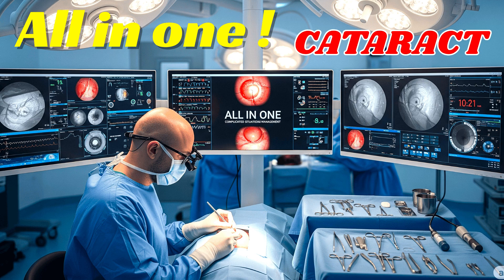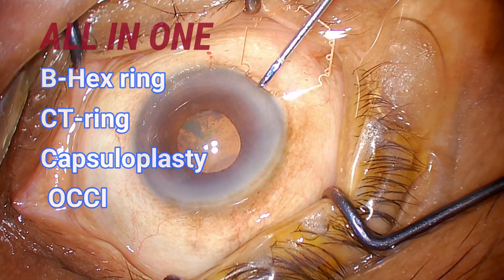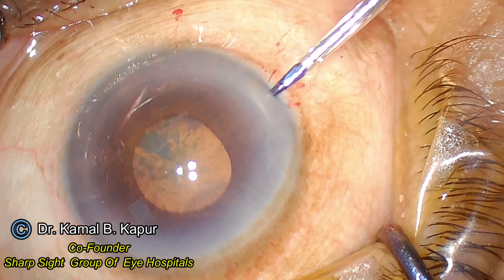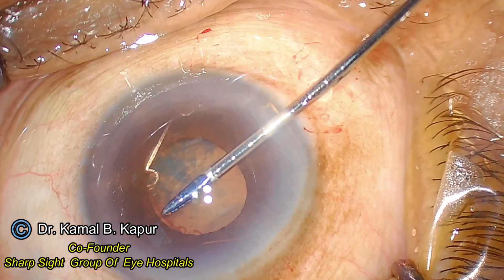This is an interesting case where the pupil is mid-dilated and non-dilating. There is a capsular zonular weakness which we will notice. The capsulorhexis was very small and vertically linearly oval, which required capsuloplasty, followed by a correction of 0.8 diopters of astigmatism because this patient was going in for a multifocal lens.